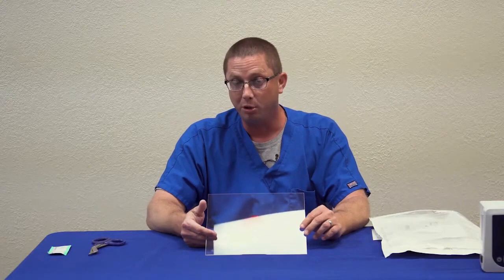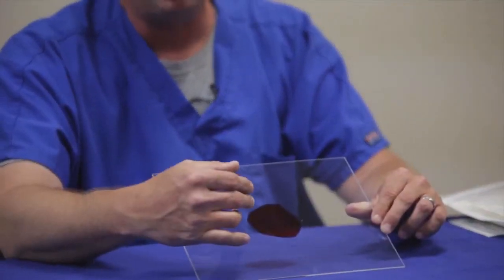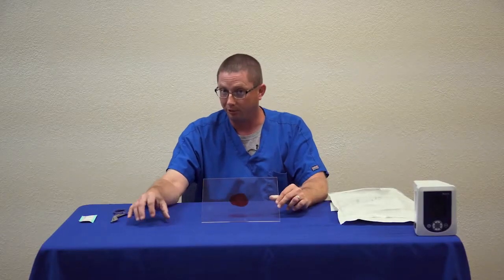In this video, I'm going to instruct you on how to apply a negative pressure wound therapy dressing. We are going to be using a foam-based dressing with your traditional drape application over the top. Per your institutional guidelines, you would cleanse the wounds accordingly per the guidelines of your institution.